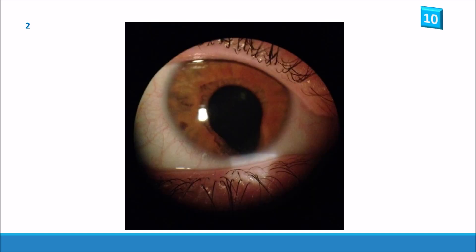Here's slide number two. It should be quite obvious but there's an incomplete closure of the iris here. So this is an iris coloboma.